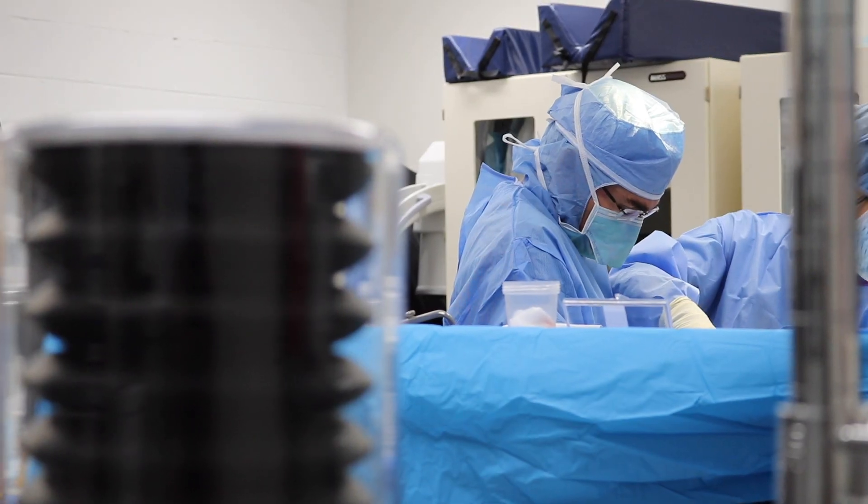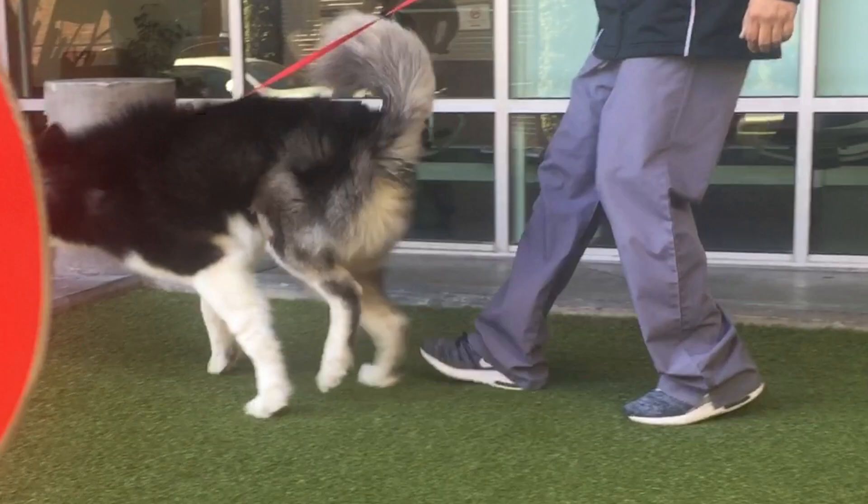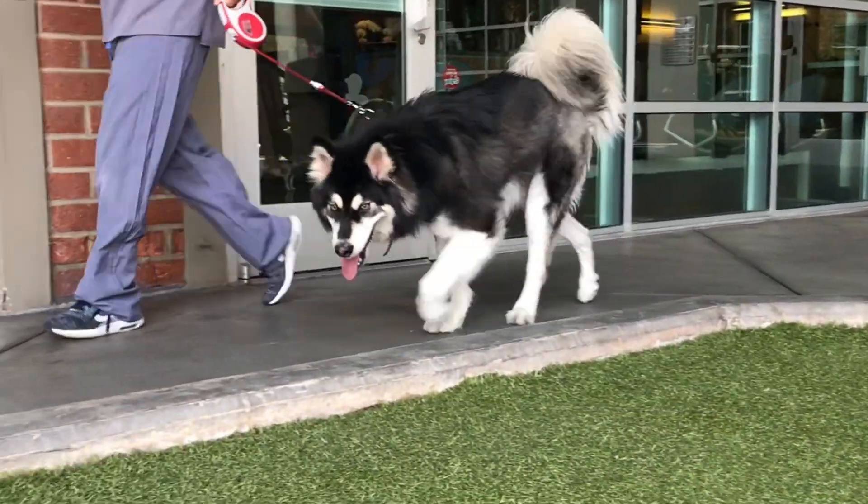However, it's one of the procedures that is associated with excellent outcome for recovery, with the expectation that dogs with knee replacement will have minimal to no lameness by the time we're done. It's not like they have never seen an injury to their knee — there was something there — but most untrained eyes will not pick up that there was a problem with that knee. Most importantly, the joint replacement has the ability to remove the pain associated with long-term osteoarthritis. Talk to anyone that has gone through knee replacement or hip replacement, and they will tell you that the best thing about joint replacement is that they feel much more comfortable after the procedure than before.